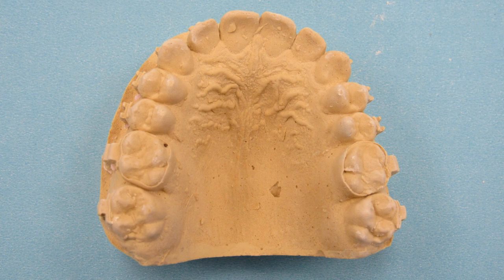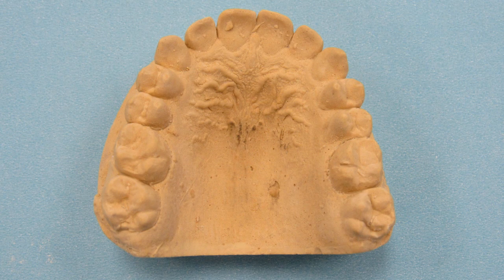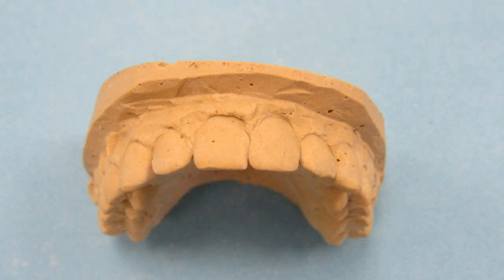Many doctors do not want to remove the patient's braces until they have a retainer to place at the same appointment. One technique that works very well is to take your impression for the final retainer with the brackets in place. Simply remove the wire, take the impression, and then place the same wire back in the braces to maintain the arch. When we receive the model, we will carve the brackets off the model and then make the retainer. You will be able to remove the brackets and place the retainer at the same appointment to make sure the teeth do not move.